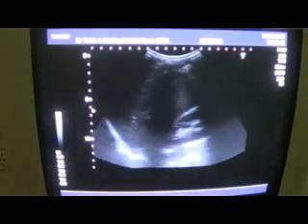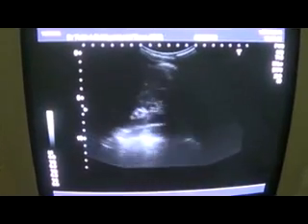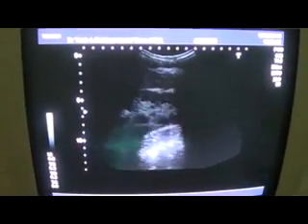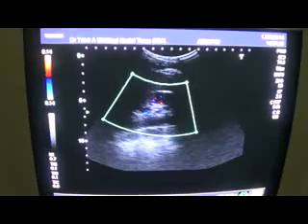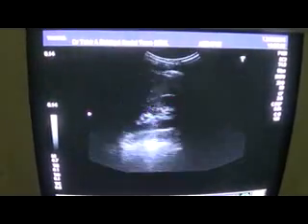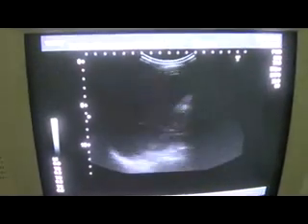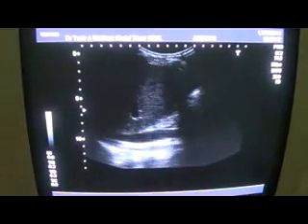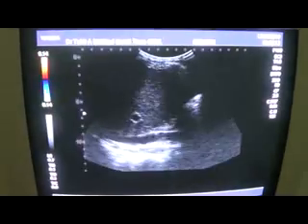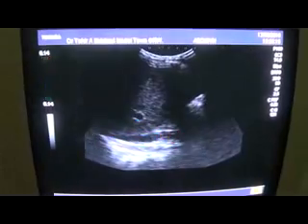first let's see where is the right kidney. Now you see this is the right kidney, and the right kidney is absolutely normal. It is being perfused normally, so nothing wrong with the liver or gallbladder, portal vein. IVC is patent. Here you see patent IVC.